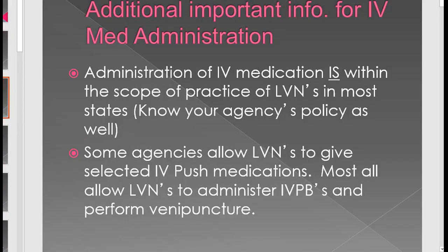Know that administration of IV medication is within an LVN scope of practice according to the Texas Board of Nursing. The role of an LVN is to administer IV fluids to stable patients and medications. They can adjust IV flow rates to stable patients according to the healthcare provider orders. They can insert IV catheters, and they can monitor for clinical manifestations of adverse reactions to IV fluids or medications. Know that some agencies allow LVNs to give certain types of medications IV push. You need to make sure that you check your facility policy to see what you are allowed to give.